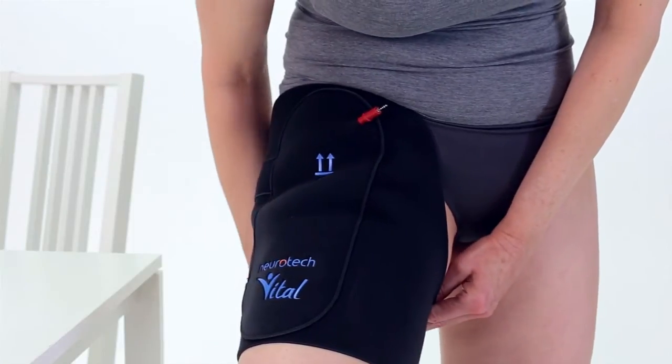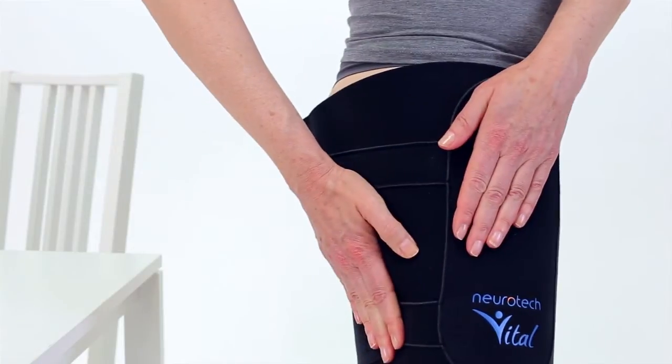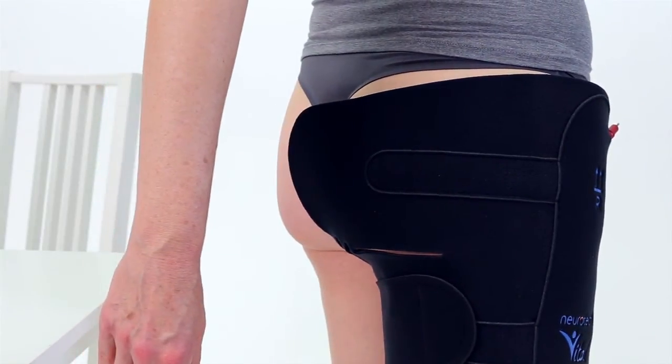Next, guide your left index finger towards the upper inner part of your groin. Wrap the strap around your leg and fasten securely. Ensure that the garment is correctly in place and that all electrodes are also in good contact with your skin.